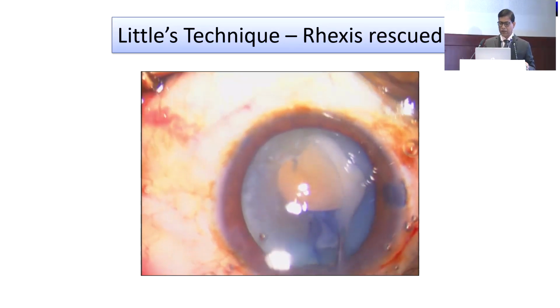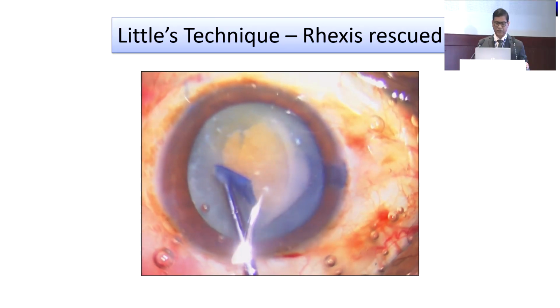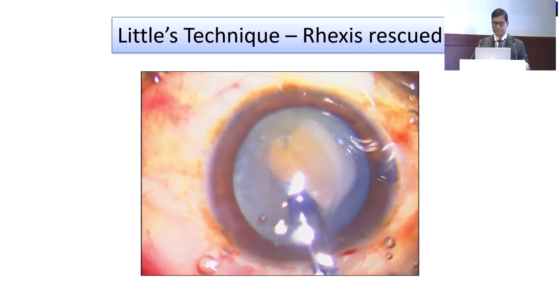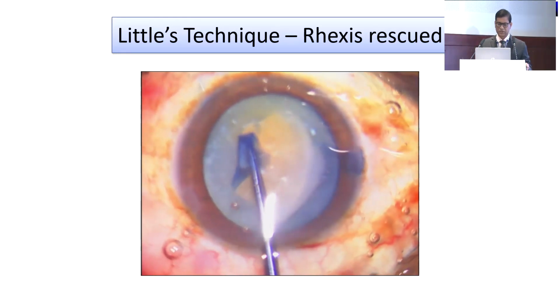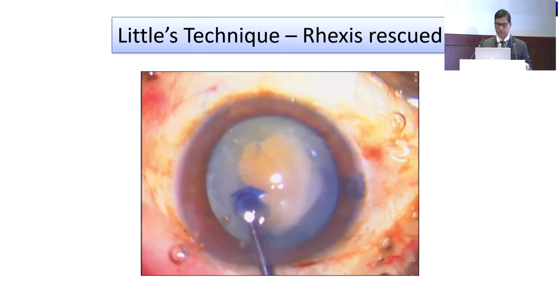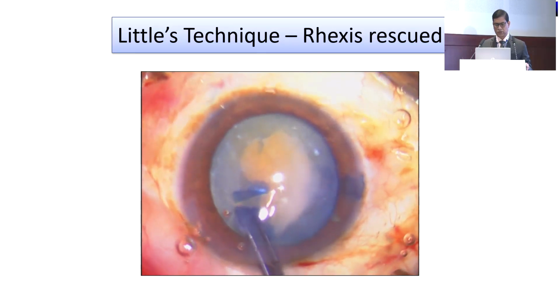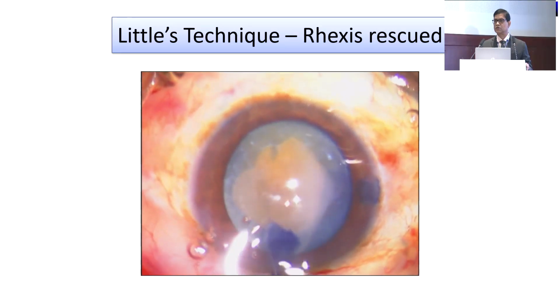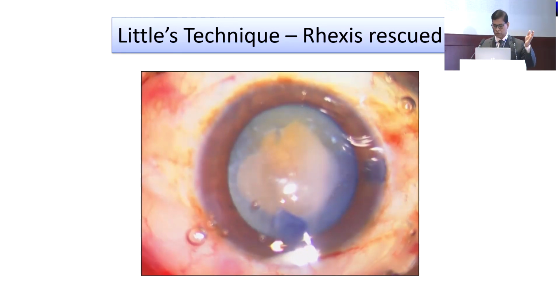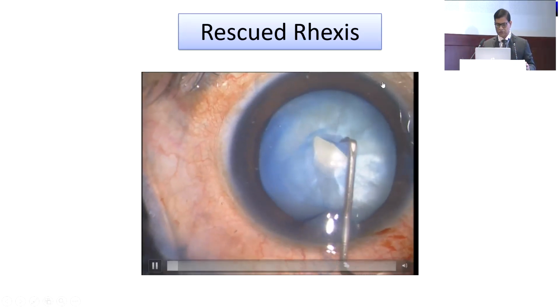Okay, now I come back and do this capsulorhexis, and I'm almost 3/4 done, and again I feel that it's going to run away. Hold it by the ear and pull it back, that's it. Yeah, so now that's the place where it's going to start running. There. So now I'm going to just hold that and give it that tug, sharp tug. You see how it moves. It moves wonderfully. You have full control. And I'll show you time and again. This one I'll have to advance a little probably.